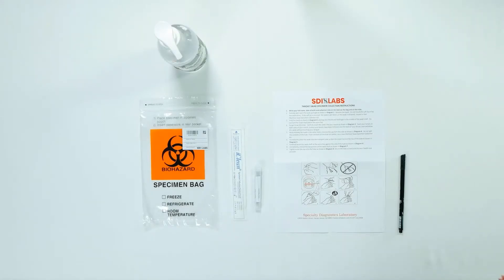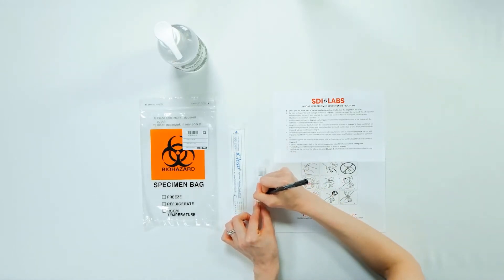When you open your kit, you will find a visual instruction set, a transport tube, a swab, and a biohazard bag.